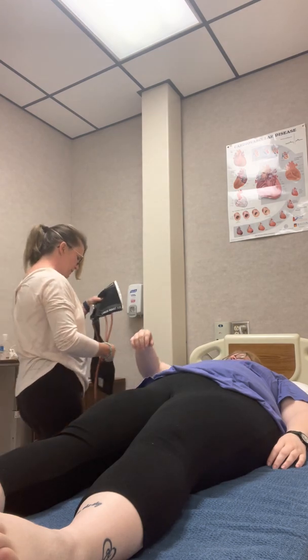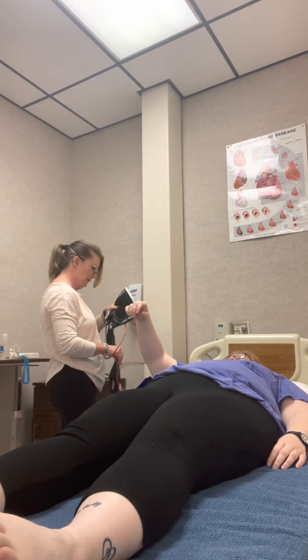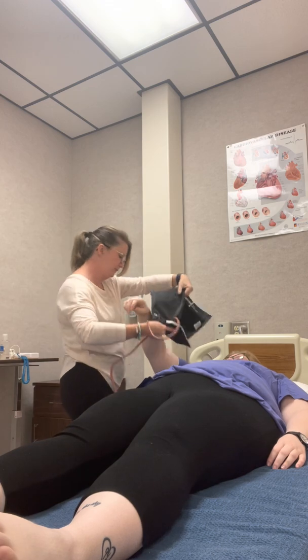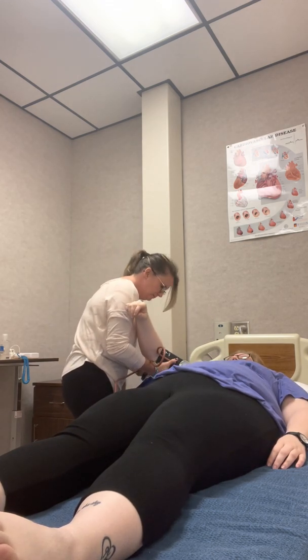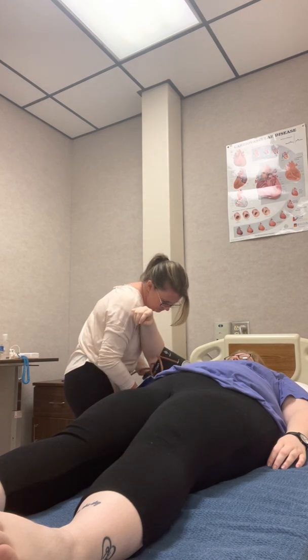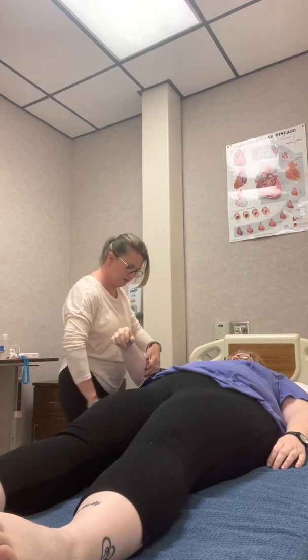Okay, let's go ahead and put this back on, and then we're going to actually take your blood pressure. Up and back. So that's a full minute. So that's normal. 97.7 is a good temperature.